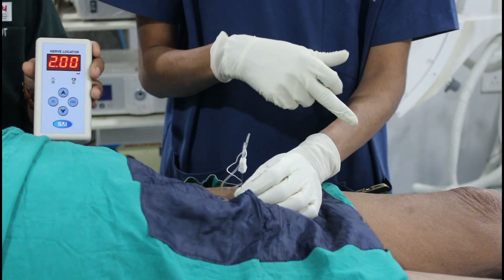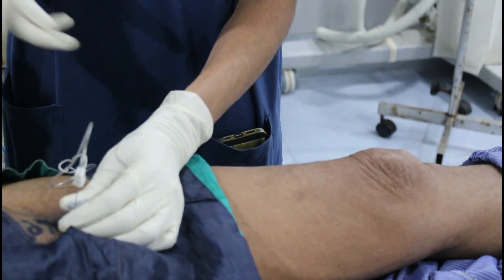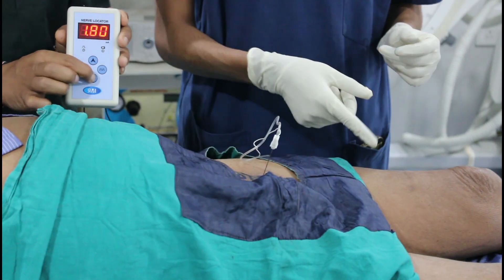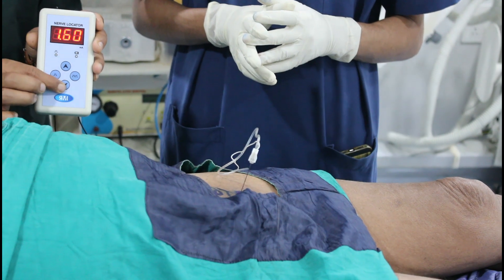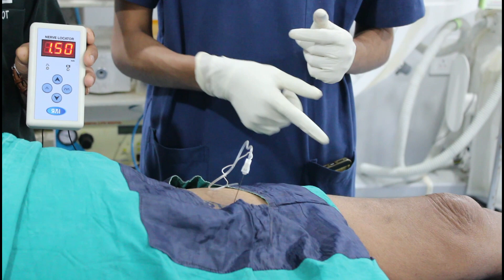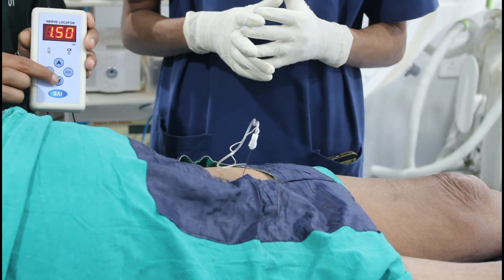You can see I am nicely getting the contraction of the adductor longus muscle at 2mA current. Now we reduce the current to 1.5mA — you can see nice muscle contractions are still coming. At 1.5mA current I am nicely getting the adductor muscle contraction. So now go up to 1mA current.